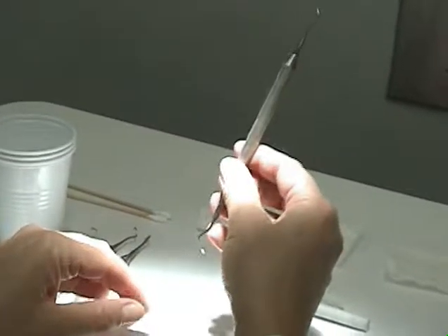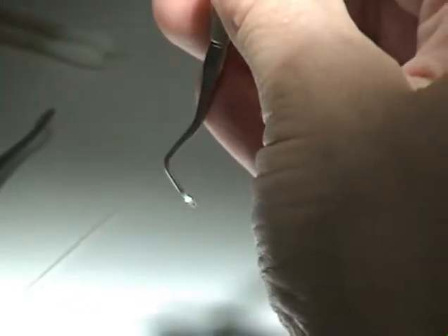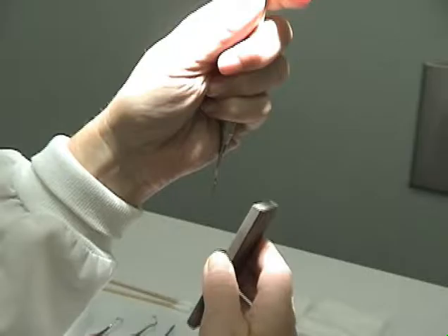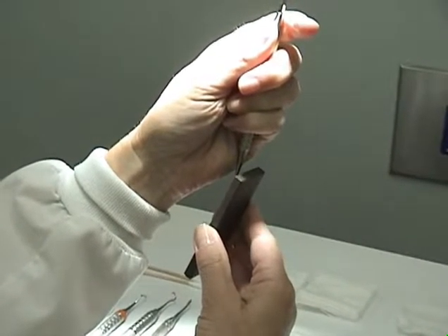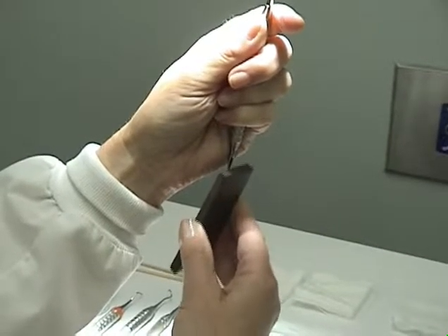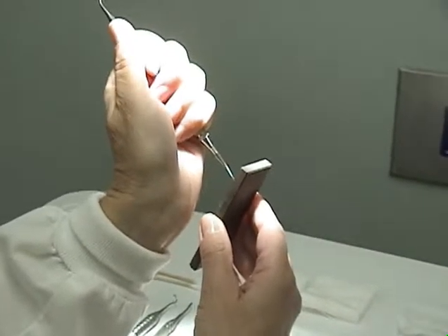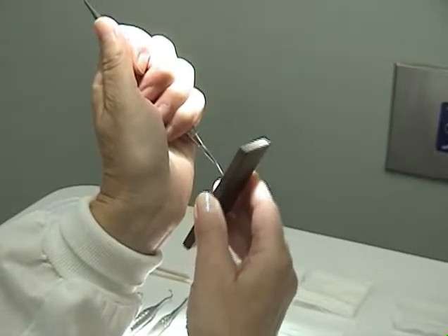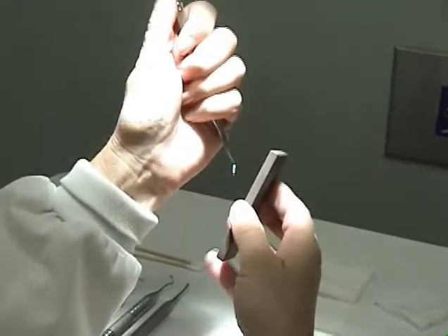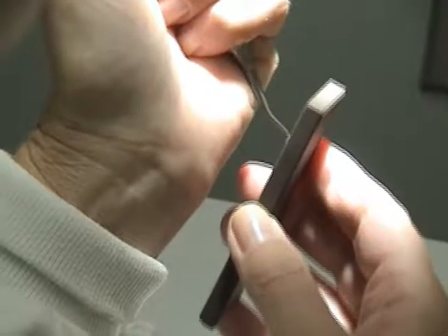The next instrument we will demonstrate is the universal curette. The universal curette has two parallel cutting edges and a rounded toe. Hold the instrument in your non-dominant hand. The terminal shank will be at 12 o'clock and the toe towards you at six o'clock. Once again, your stone will be at one o'clock. Begin sharpening in three segments, then rotate the instrument so that the toe is pointing away from you, repeating the sharpening technique. Wipe the sludge, flip the instrument to the other end, and repeat with the terminal shank at 12 o'clock and the stone at one, starting with the toe towards you.